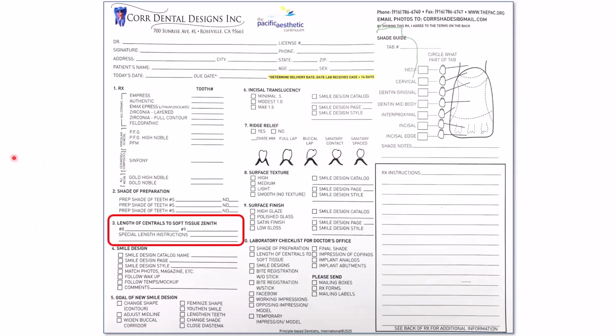So you have your patient, and you've got your smile design selected. You want the nice, soft incisal edges that are slightly rounded. So we fill out the lab slip. The lab slip is going to say, hey, how long do you want 8 and 9 to be?